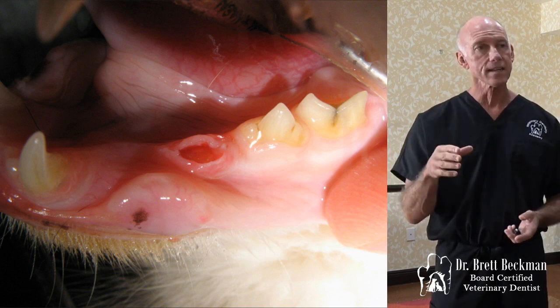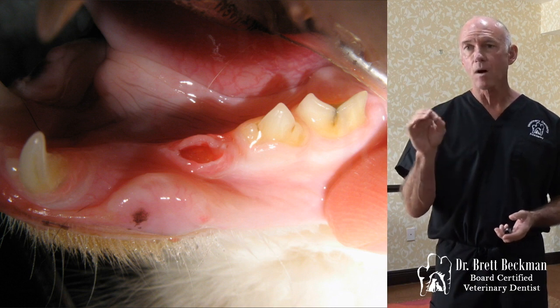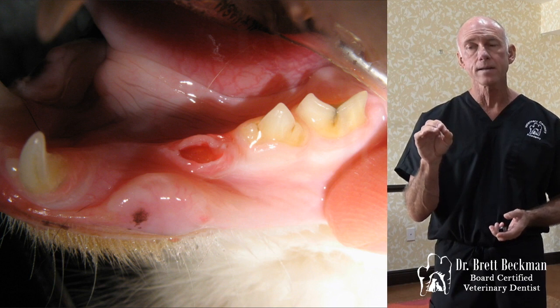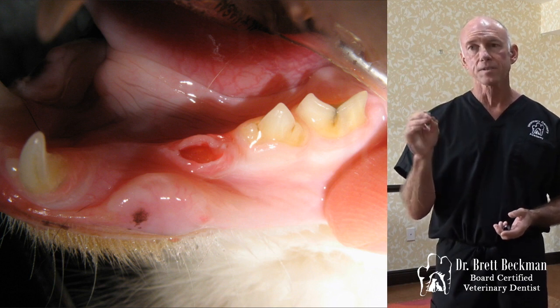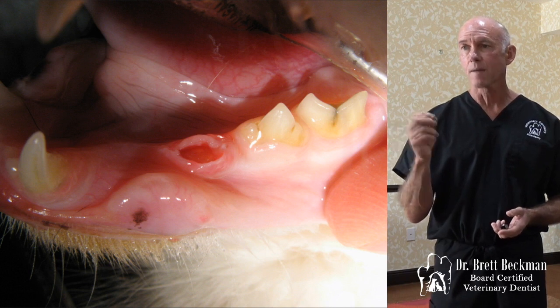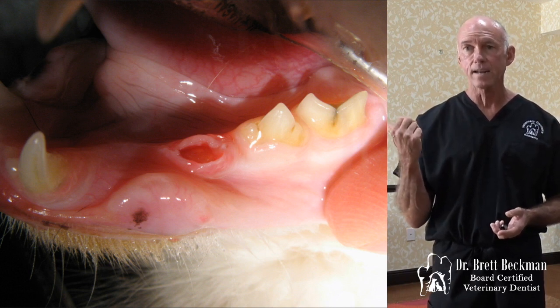So open it up so you can see it. Take your diamond football burr, or a round carbide if you're real careful. You want to be careful with that because it has flutes in it. It can grab the gingiva and cause trauma, so you want to avoid that if you can.